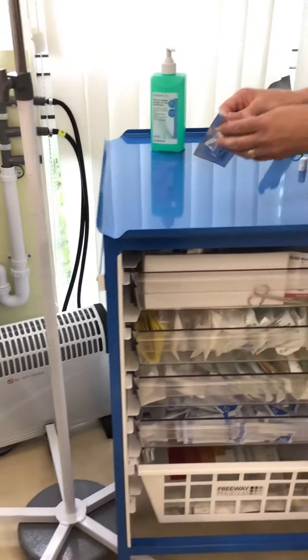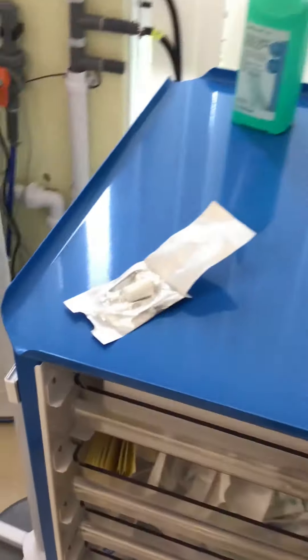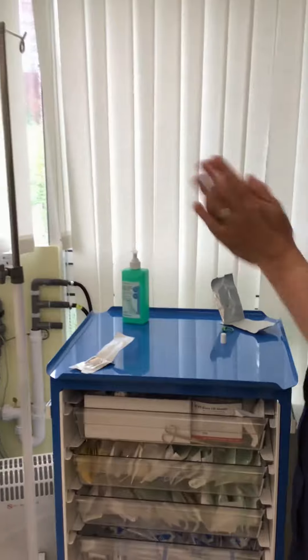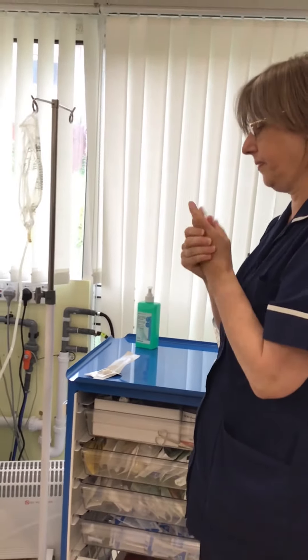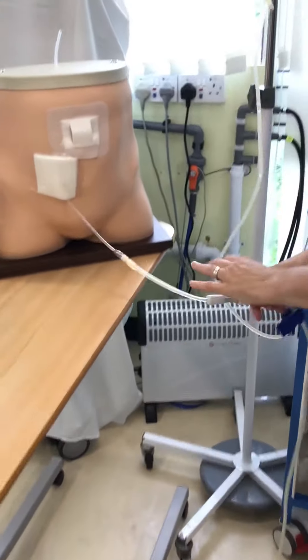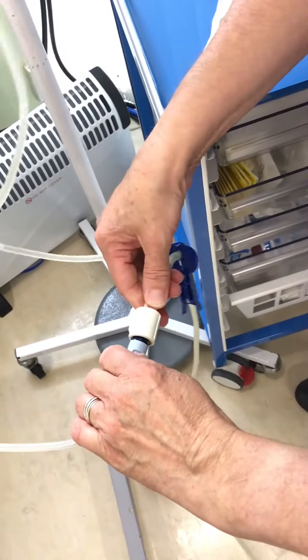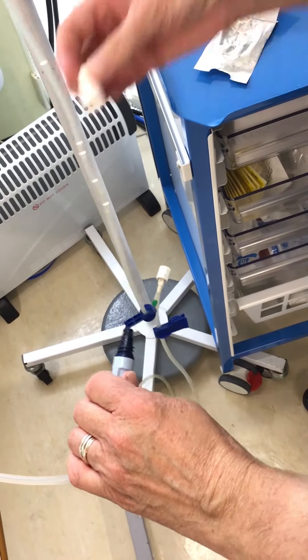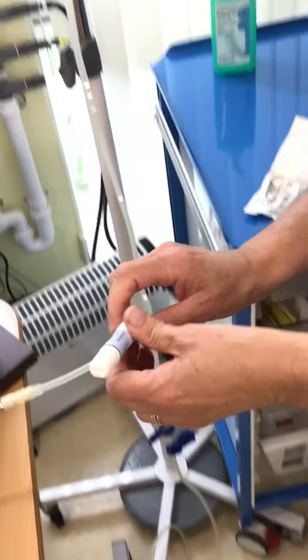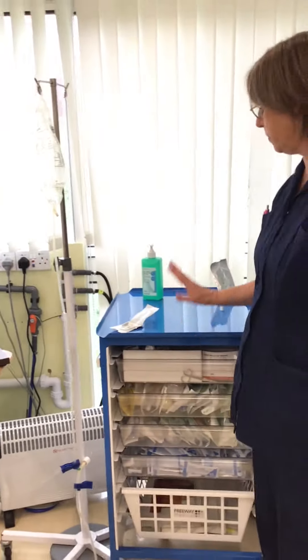Then you need to open your cap packet. Again, if the cap rolls onto your clean surface, throw it away and get another cap. Once you've opened the packet, alcohol your hands and then safely disconnect. Hold your line with one hand, with your other hand untwist. Discard the lines, pick up your new cap, and carefully apply without touching the dark blue end. Then tuck your line away and clean up and tidy away all your rubbish.